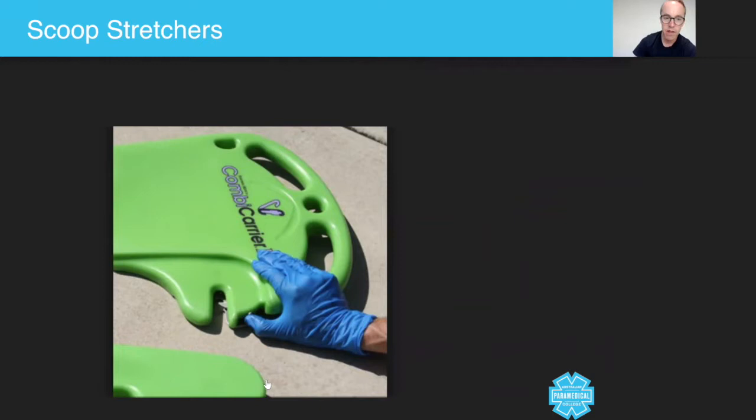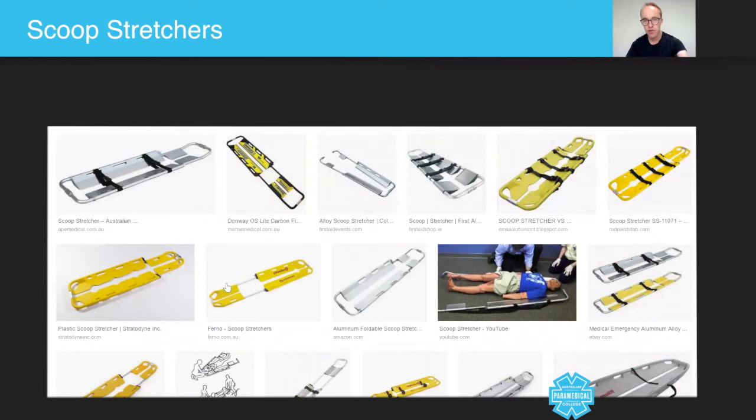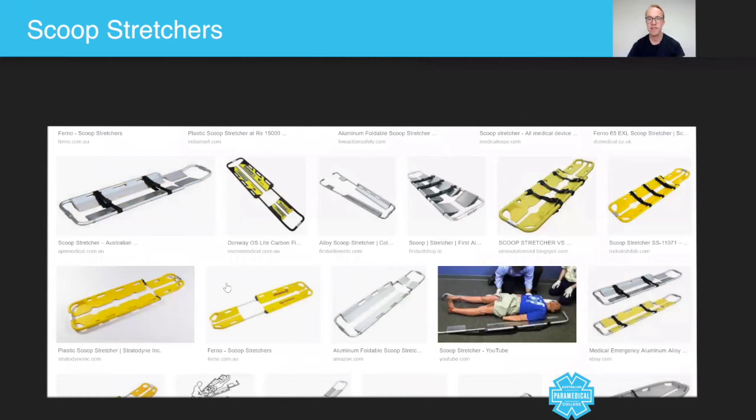There are other types of stretcher that look similar and act in the same manner, including the scoop stretcher. If you just type in 'scoop stretcher' you can see all the different types — they are all designed to scoop your patient up, separating and going under each side of the patient before clipping together. Some materials are better than others; for example, these aluminium ones are not ideal because they are very effective at lowering and raising your patient's body temperature, which is something you don't want.